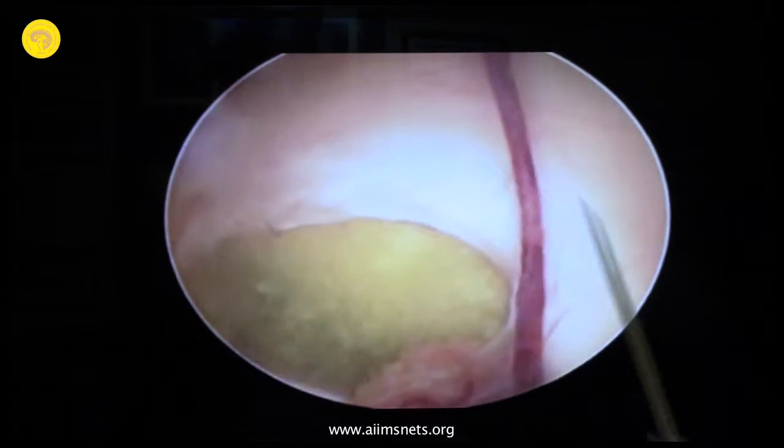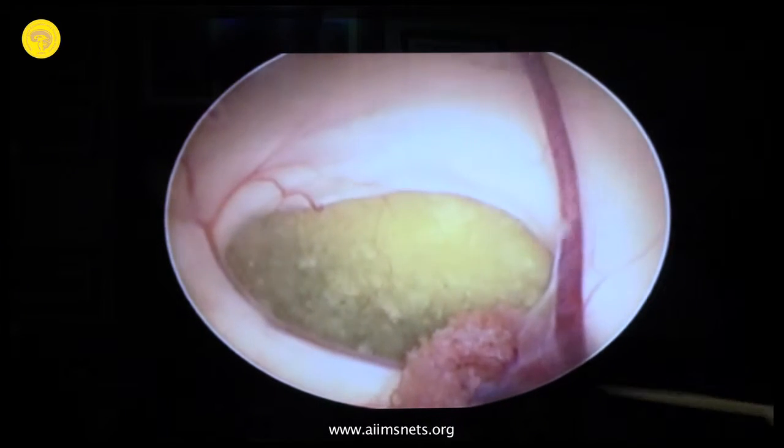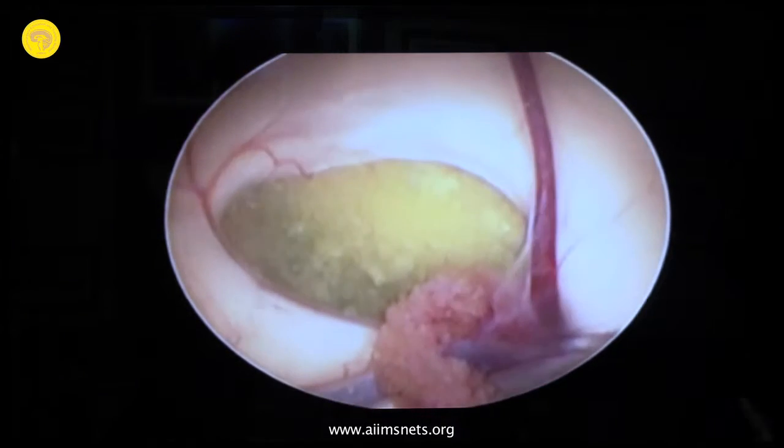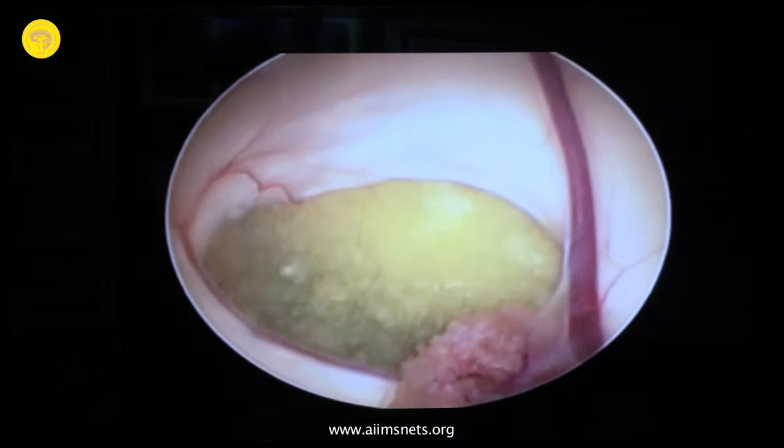This is the craniopharyngioma at the foramen of Monroe, and this is the septal vein. Like I told you, this is the choroid plexus, and this is the tube. So you see, this is here. Now comes the interesting point.